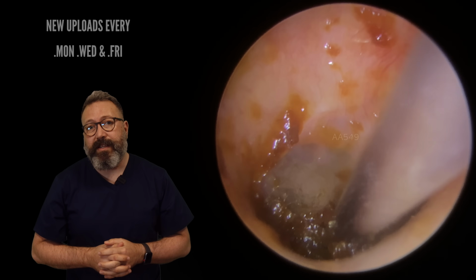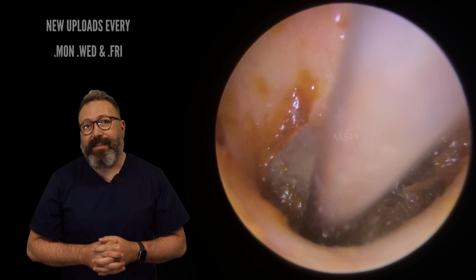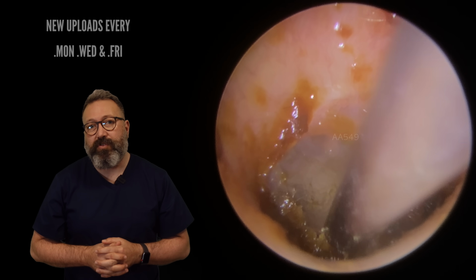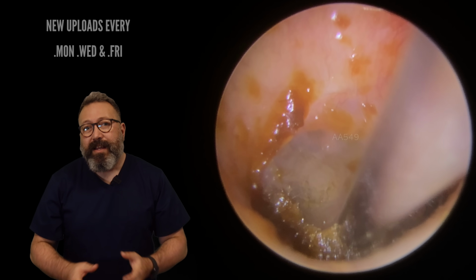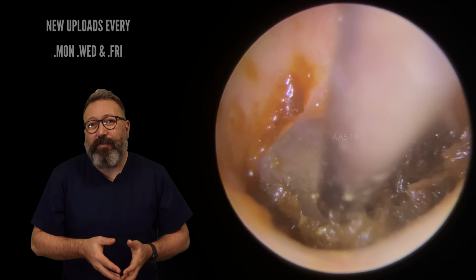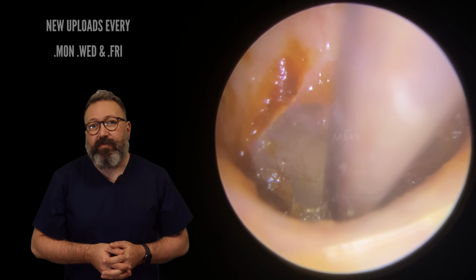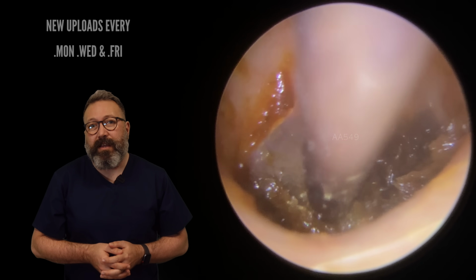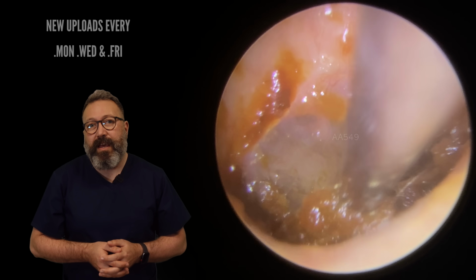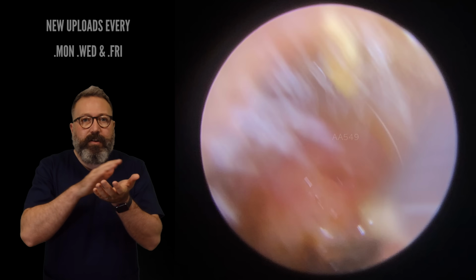But you can really see how it's all stuck down into that recess, and this skin layer doesn't want to give up the fight at all. It's really holding on. You can see I'm trying to lift this, coax it over the top of the recess. Oh, it's really hanging on in there. There we go, there we are. See, those are the sort of layers that we've got in here. So we've got layer upon layer upon layer.